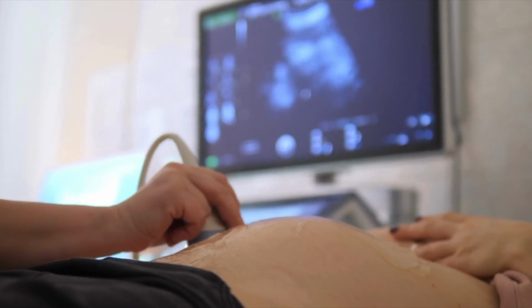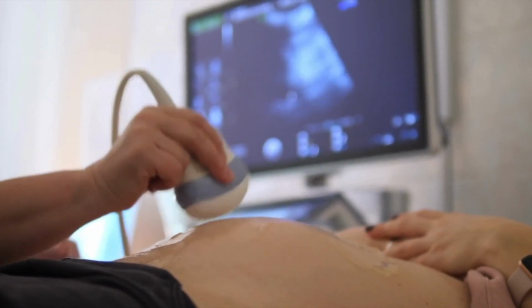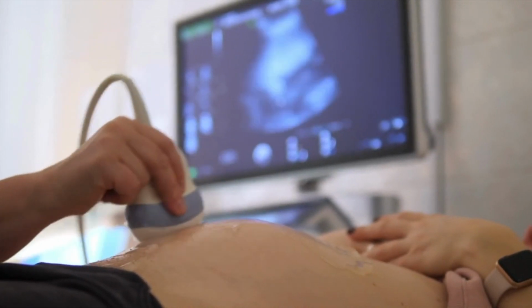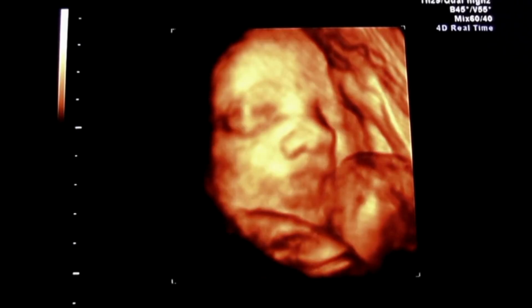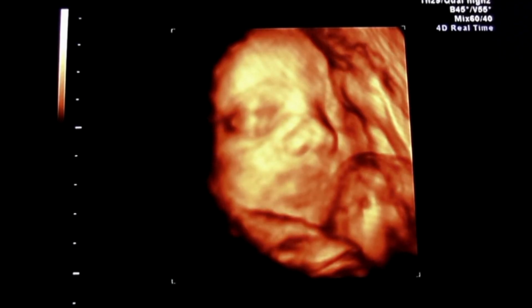There are various types of ultrasound. There are 2D ultrasounds, which produce flat, two-dimensional images of internal organs. They're commonly used in obstetrics and also in abdominal imaging. There are 3D ultrasounds, which provide three-dimensional images, offering a more detailed view, especially useful in fetal imaging.